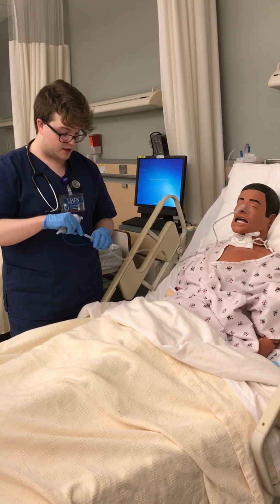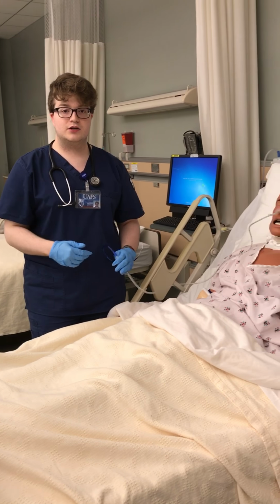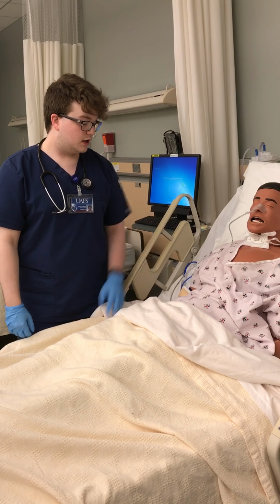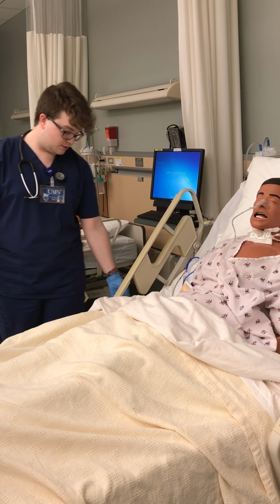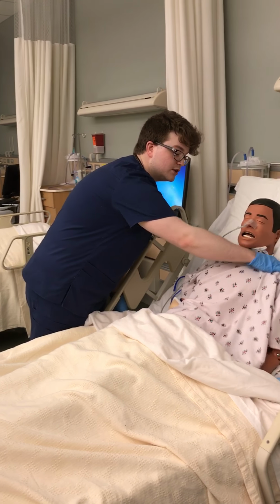Anyway, so I would hook it back up because you can't put it to suction for another 30 to 45 minutes to give the medication time to absorb. So I would leave this here and make sure the patient didn't need anything else, lower back to the bed and clean up my area, and that is giving a medication through the NG tube.